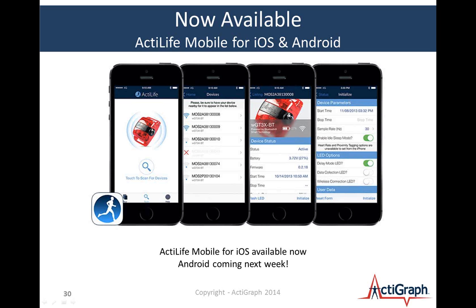I want to mention just here at the end, we now have an ActiLife mobile app available. It's currently available on iOS, for iPhone 4S and up. This particular application is simply listing devices wirelessly, initializing those devices and capturing the status. We are moving into some more advanced features for that. But first, we've got an Android app coming out next week that does the exact same thing. And so by next week, you'll have Android and Apple ActiLife mobile applications available.